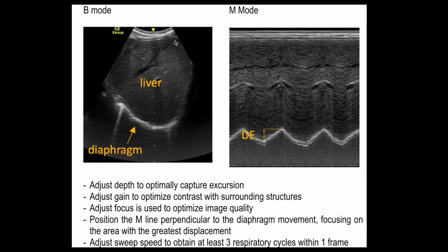Once you have the optimal image, switch to M-mode. Position the M-mode line perpendicular to the movement of the diaphragm, focusing on the area of highest movement — it is better to aim centrally rather than to the sides. Adjust the sweep speed to obtain at least three respiratory cycles within one frame.